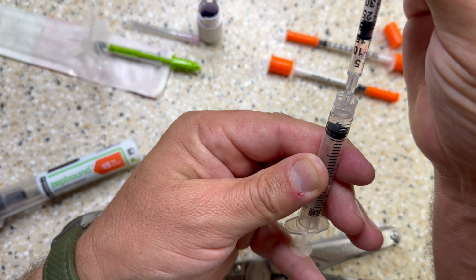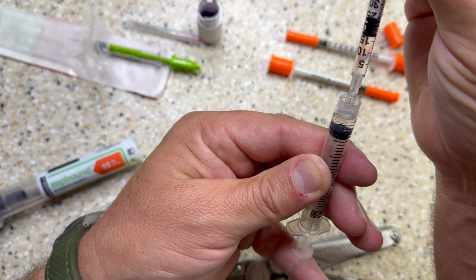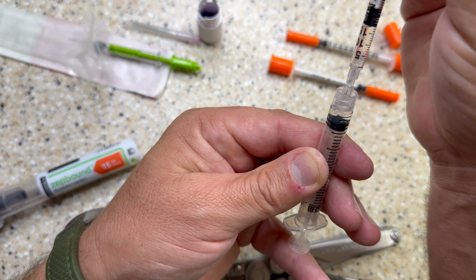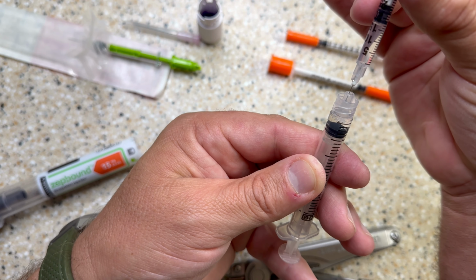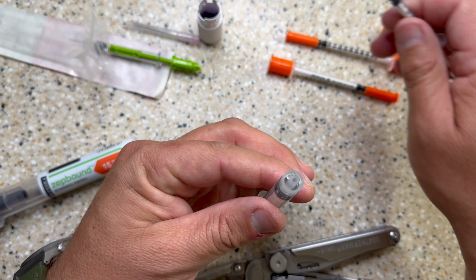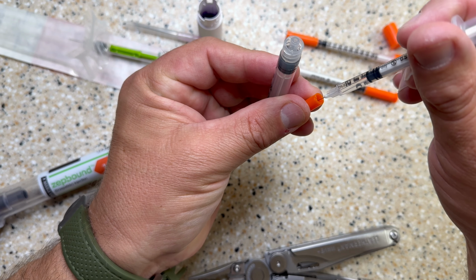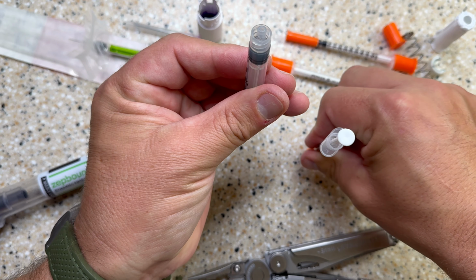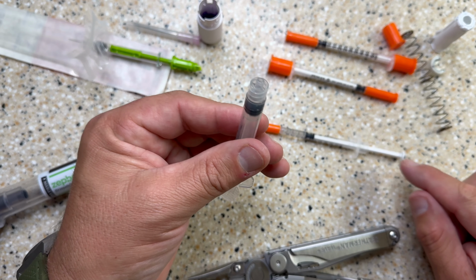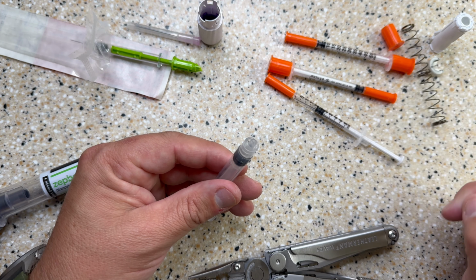So depending on your prescription, you can draw it out to whatever you need it to be. And this is where I'm going to draw for this one. My goal was 17, and I'm there. So what I do now is I'll just go ahead and replace it back in. I'm going to draw this out just a tiny bit, and then I can put this in the fridge for safe storage. And I can repeat those steps necessary for the other two.